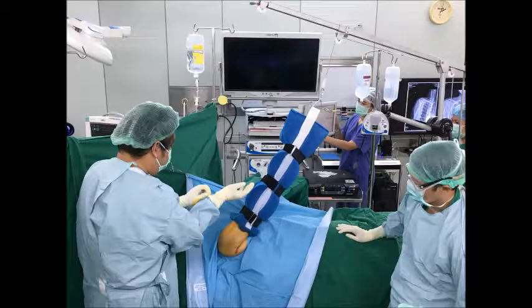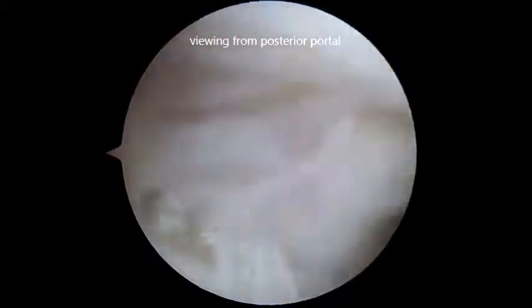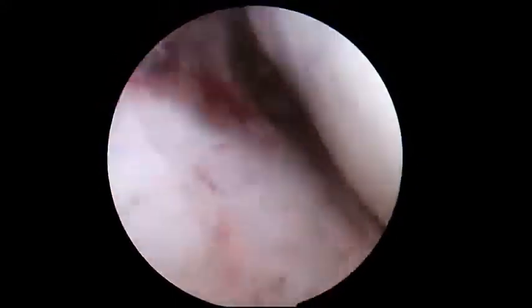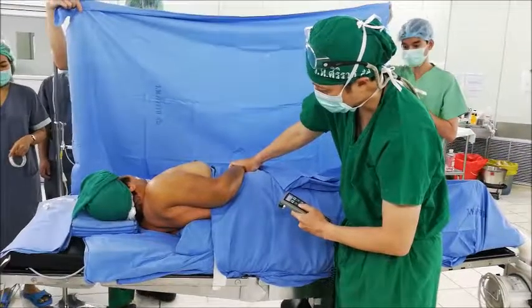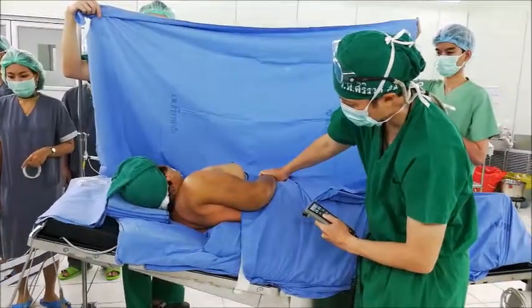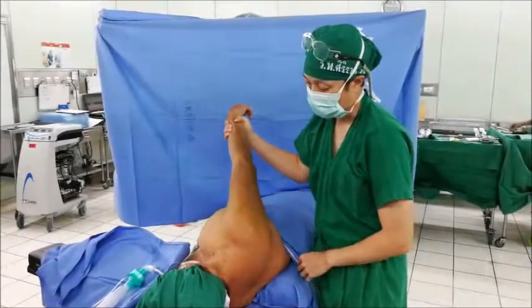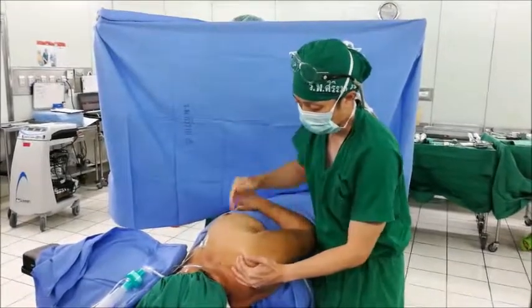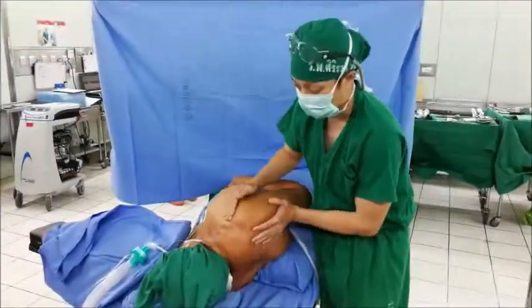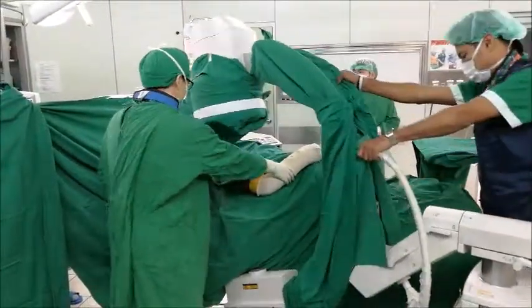This is a modified semilateral decubitus position. The surgeon is performing an arthroscopic examination. The position of the patient is adjusted to a more upright position using the motorized controls to achieve 30 degrees of hip flexion. Without traction, the scapula falls back due to gravity. This position allows for adequate motion of the shoulder, similar to the beach chair position, and the arthroscope is convenient for lateral evaluation.